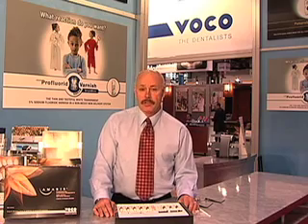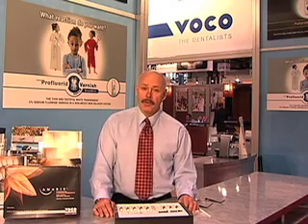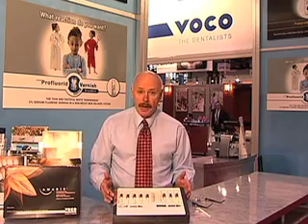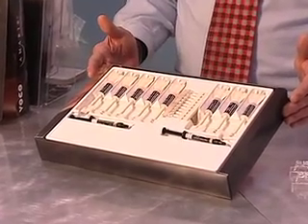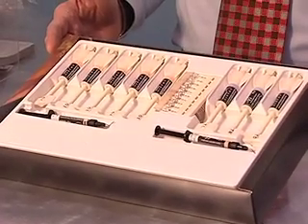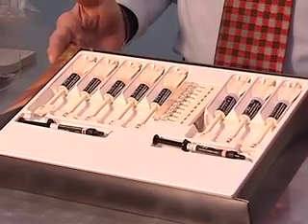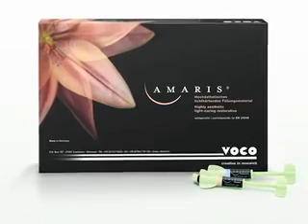A lot of composite systems I can teach have multiple shades, multiple opacities — 24 shades, up to 32 shades with tints and opaques. The VocoAmerica system, as you can see right here in the box, is very easy to understand. It has eight shades: five opaque dentin shades, three translucent shades, and very interestingly, two flowable components — a very translucent and a very opaque.